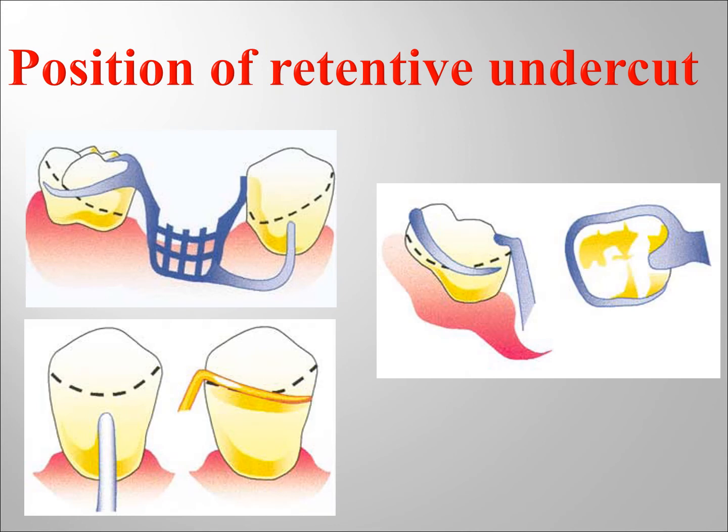Again, the simplest example is the simple circlet that we use if the deepest undercut, or the most favorable undercut, is positioned away from the edentulous saddle. It goes from the edentulous saddle towards the other side. While if you cannot use it, if the deepest undercut is located next to the saddle, then you have to use another option, ring clasp in this slide for example. Also for gingivally approaching clasps, whether you have to use T, half T or I depends also on the position of the retentive undercut.